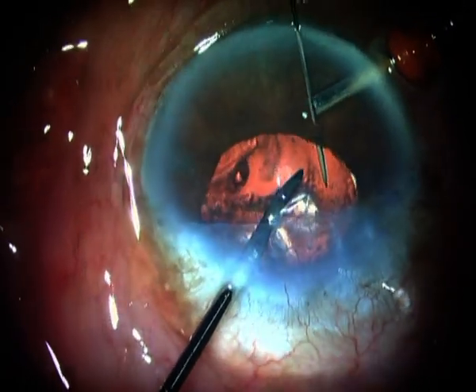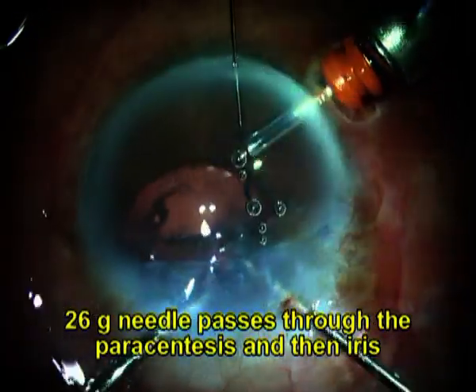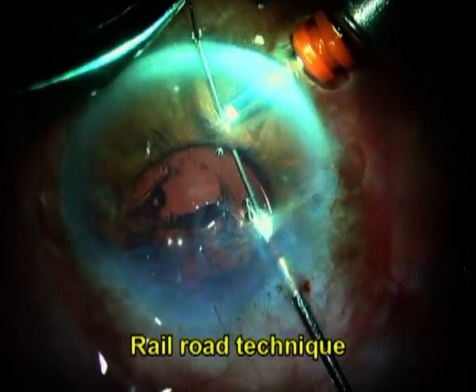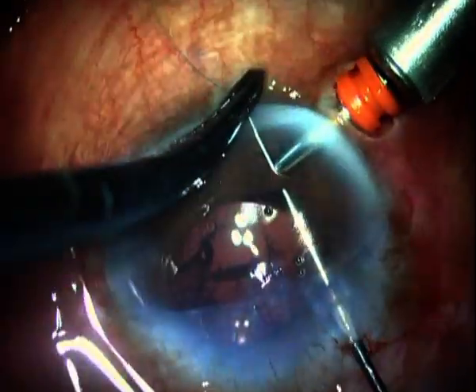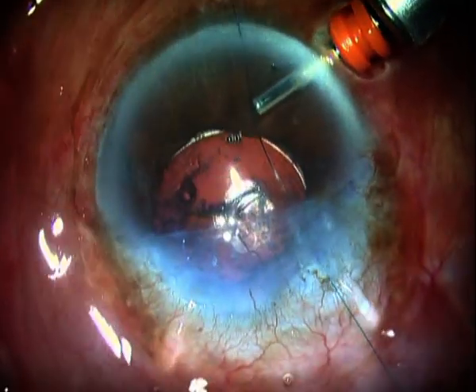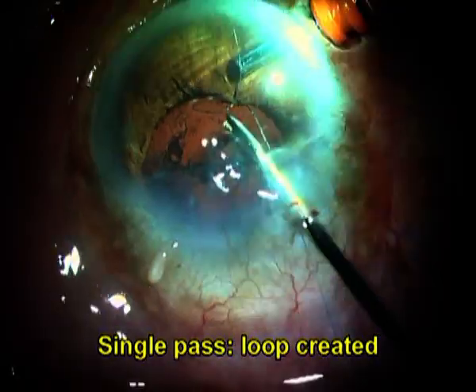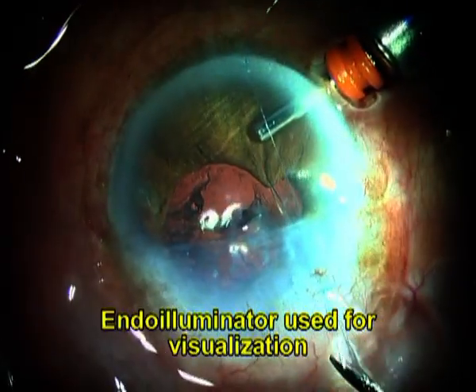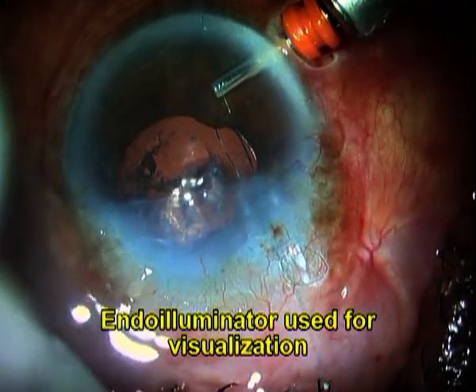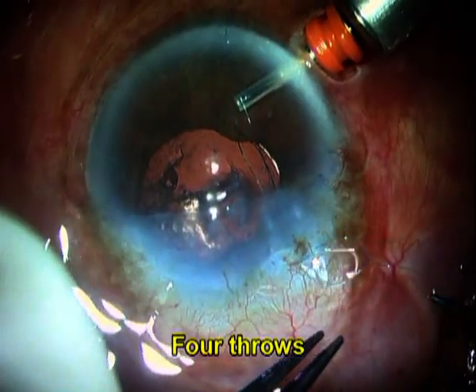A straight needle 9-0 or 10-0 Prolene suture was passed through the cornea and the iris. On the other side, through a paracentesis, a 26G or 30G needle was passed through the iris. The two needles were connected with the railroad technique and the suture loop brought out as a single pass. 4 throws were then passed through the loop to create the single pass 4-throw pupilloplasty.